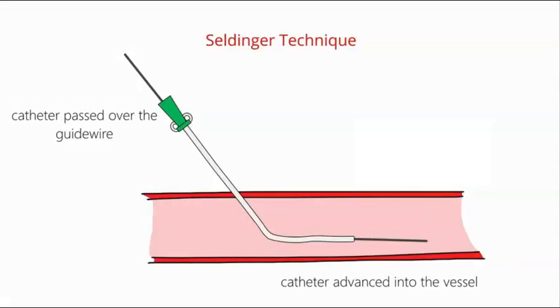This entire technique of using an introducer needle and then a guide wire is called the Seldinger technique. This is used in many other procedures in emergency medicine, such as arterial lines and pigtail chest tubes. This wire is now essentially a placeholder that will guide your CVC into the correct location — the internal jugular in this case.